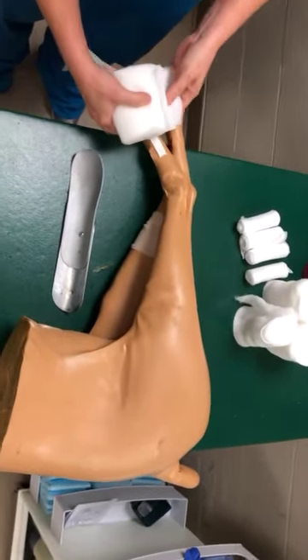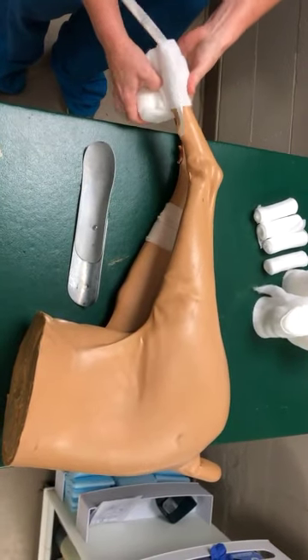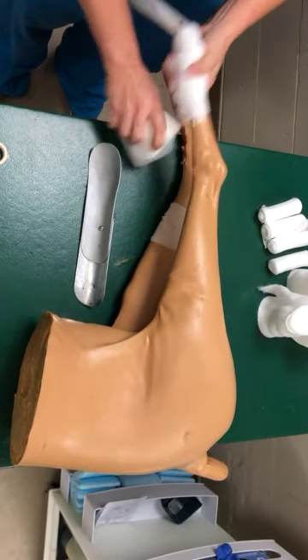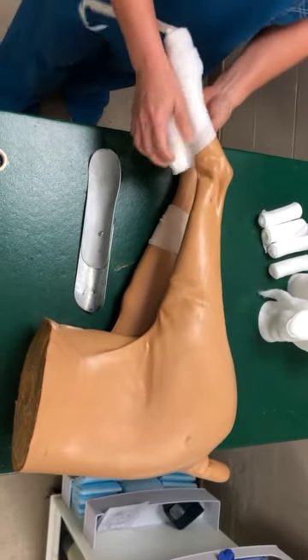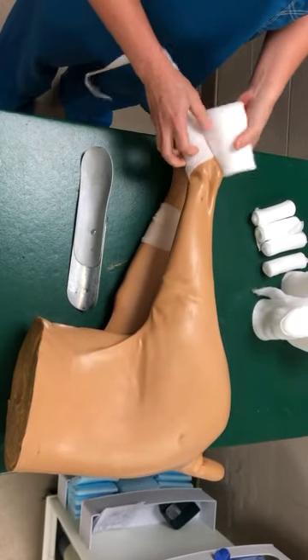The first layer we will use today will be our cast padding. You can pull it as tight as you want — it will tear before it gets too tight, and that is totally fine if it does. Just lay it back down and continue. You want to pull it nice and snug and try to get the little bumps to a minimum.